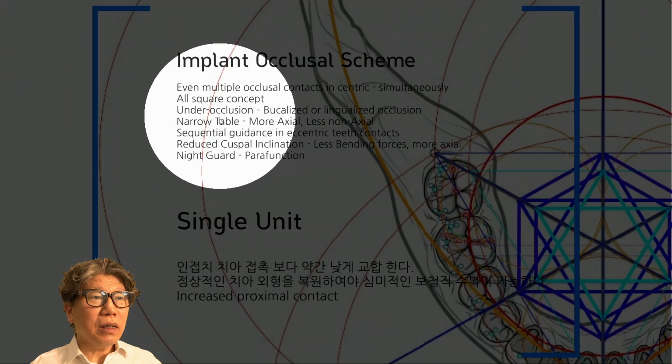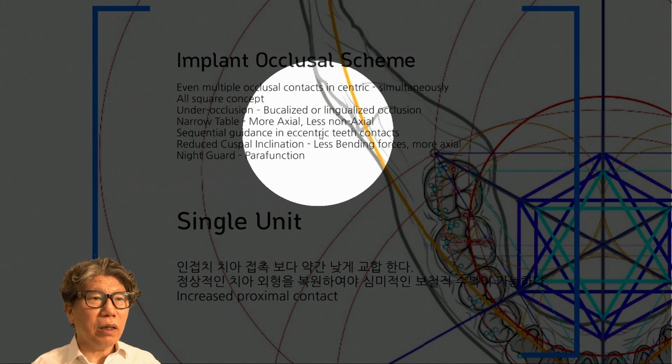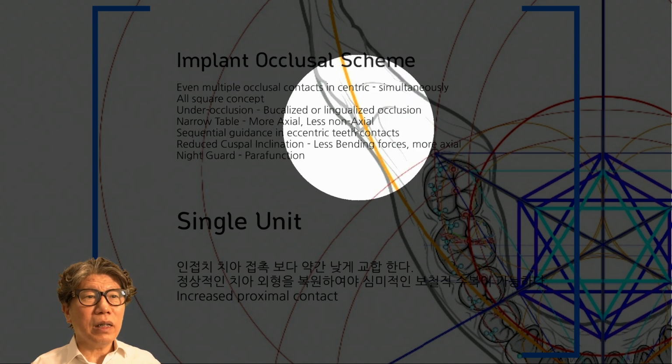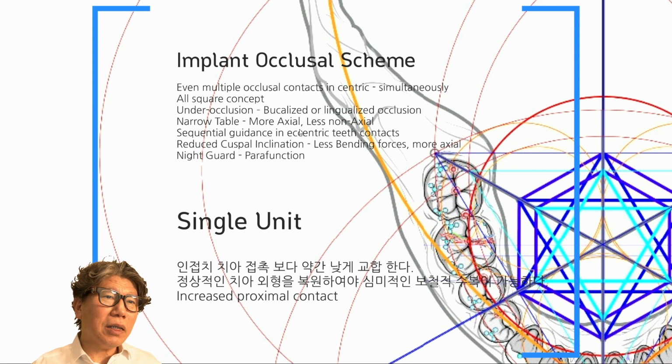Next, the occlusal surface should be reduced. Narrow table. And then, allow the occlusal force to move axially towards the center and reduce the non-axial force. This is the protocol. So it would be good to understand this protocol well.